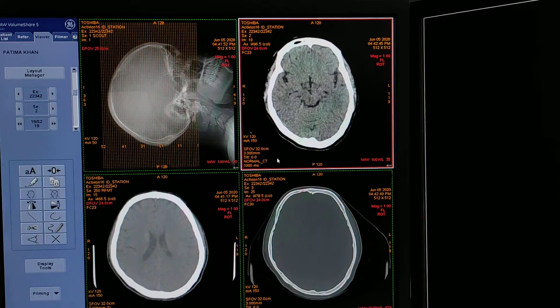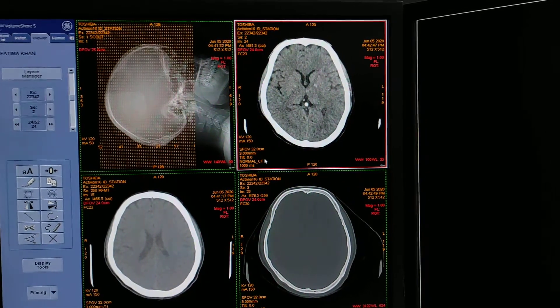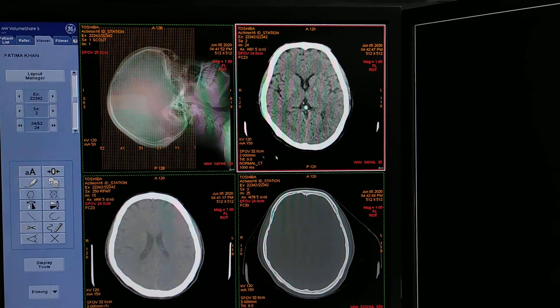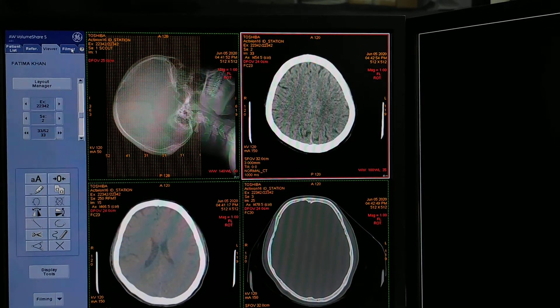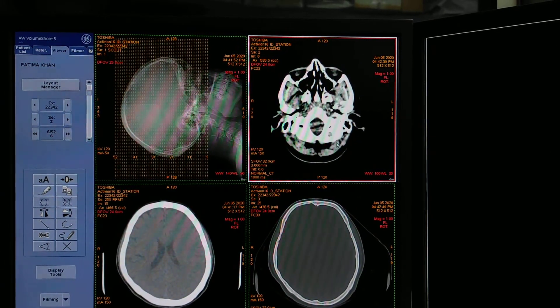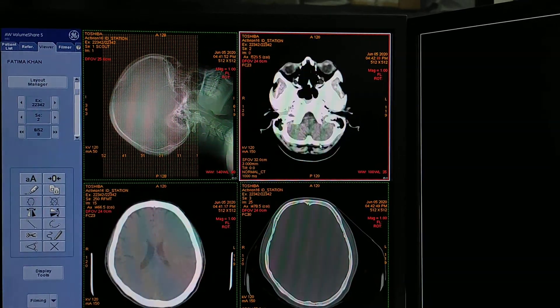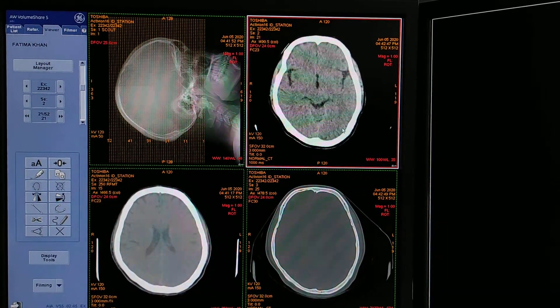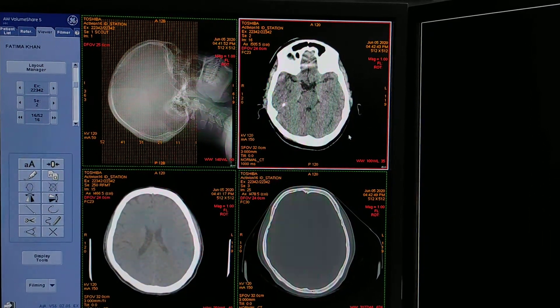First of all we will see brain plane. Whenever you are doing a brain plane scan only, you should give a format of 30 images — with the scanner it will look good. Click on the filmer. You can enter the images in the film by pressing F1 on the keyboard. First of all, select the starting point and ending point of the scan and check out how many images you have taken in that scan.